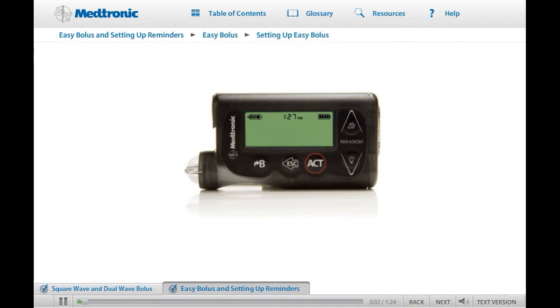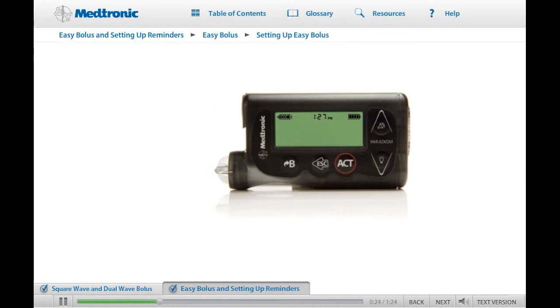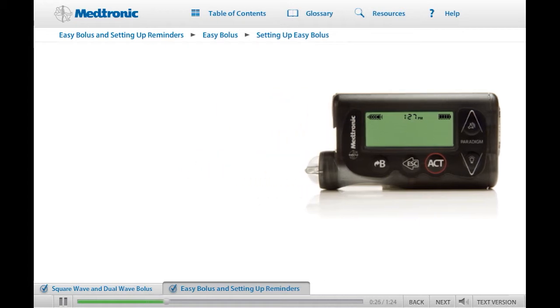The Easy Bolus button provides a way to deliver a normal bolus by pressing the up arrow when the pump is on the Home screen. You can program the pump so that each press of the up arrow button increases the bolus by a fixed amount, called a step. You can then easily enter your bolus amount with a few presses of the up arrow button. To set up the Easy Bolus function, first check to make sure it is turned on. On the Bolus menu, select Bolus Setup and press Act.